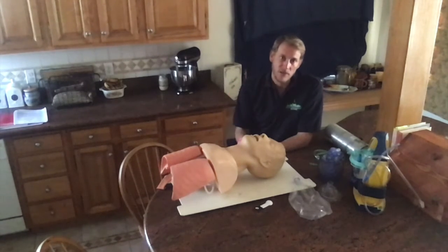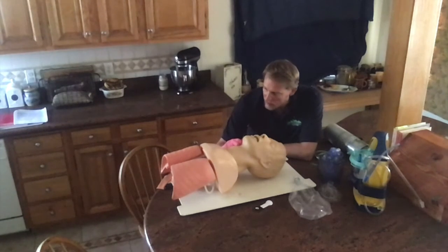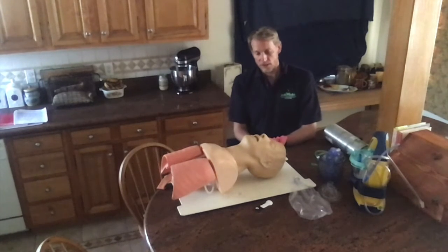I'm going to call for ALS backup. I'll check for the carotid pulse and breathing simultaneously. It appears this patient is apneic and has a weak pulse of 60 beats per minute.